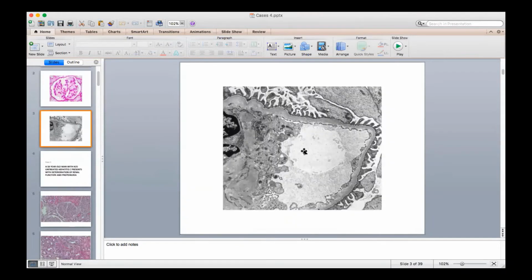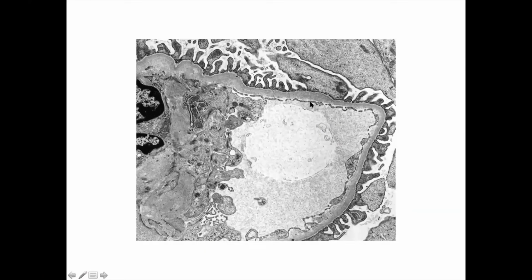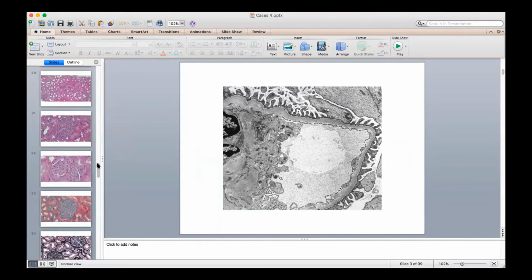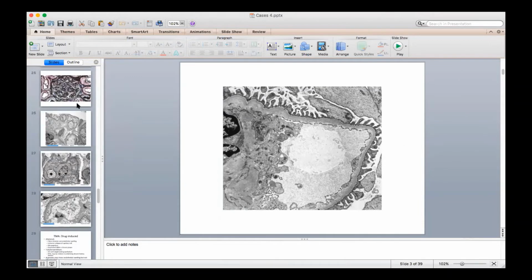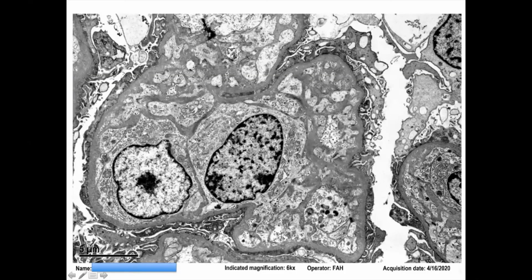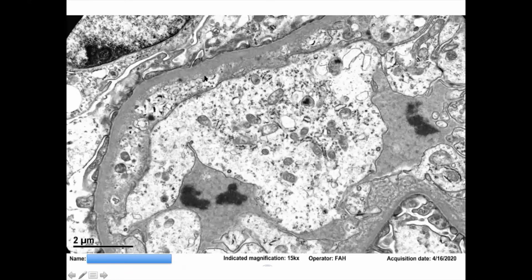Look how flat she is over here, right? And then when she gets irritated and upset and injured, what does she look like, right? So this is endotheliosis, this is endothelial swelling, and then this is what we're talking about, subendothelial lucency in the glomerular basement membrane.